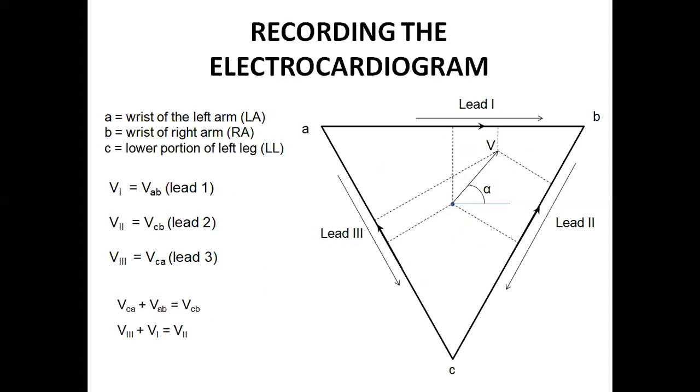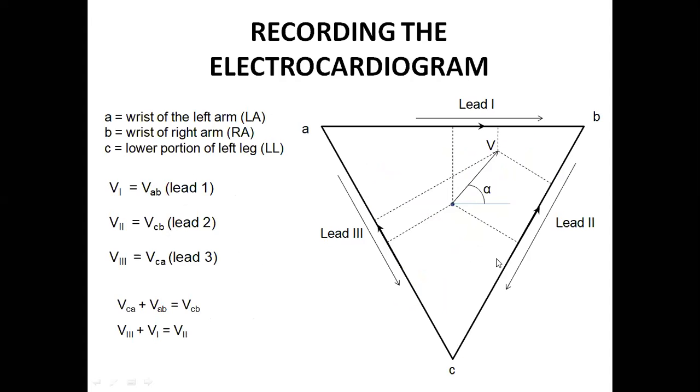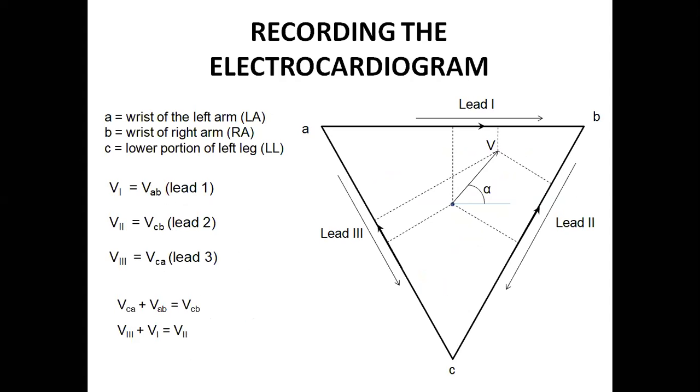This is a photo that was downloaded from an internet source, so we can't change anything in it. To better understand, I have drawn this diagram. Okay, so whatever, where we are. Now the lead 1, lead 2, lead 3 concepts are clear. Yes, sir.